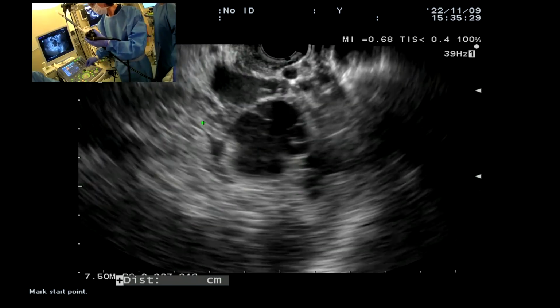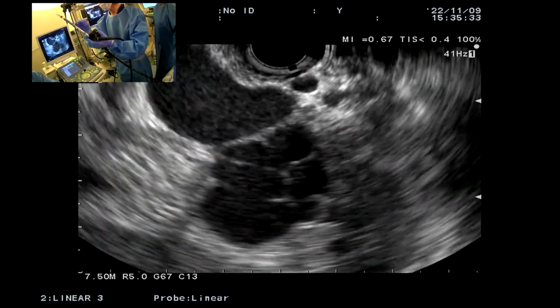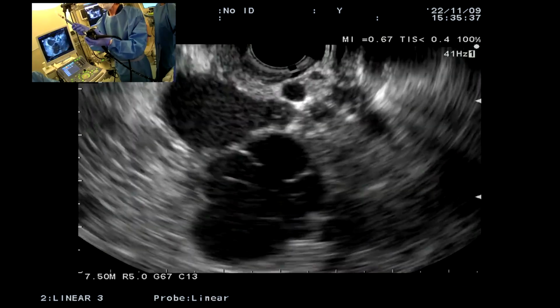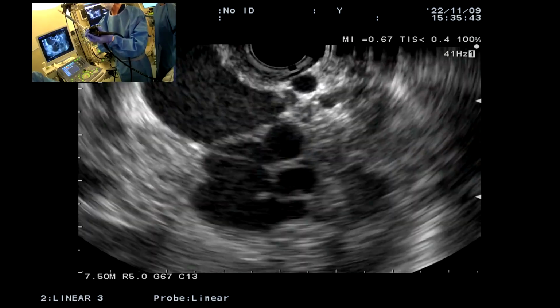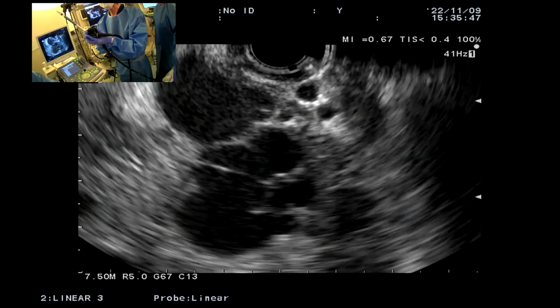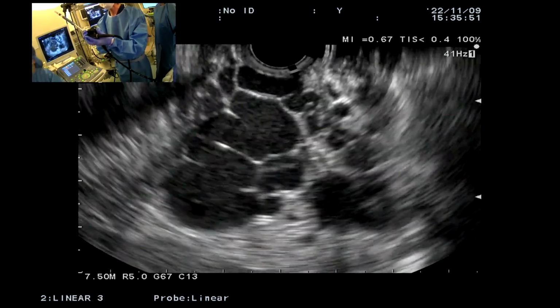That's good. Now I'm going to zoom in a little bit. So the first step is going to be to just advance this forward. And it's actually always wisest to advance the sheath first. If you do advance the needle, just make sure you're never pushing against resistance. So there you can see the sheath moving. You see it. I'm going to pull it back a little bit.